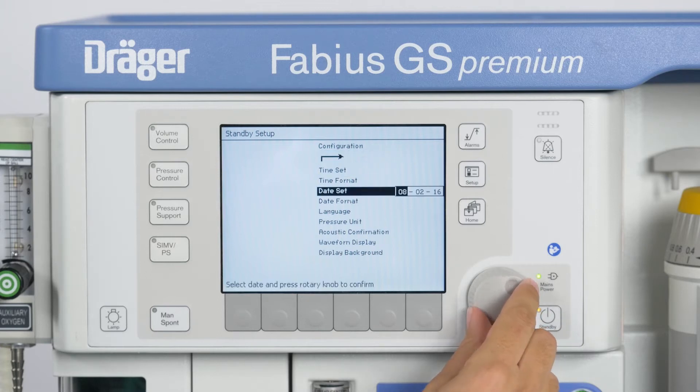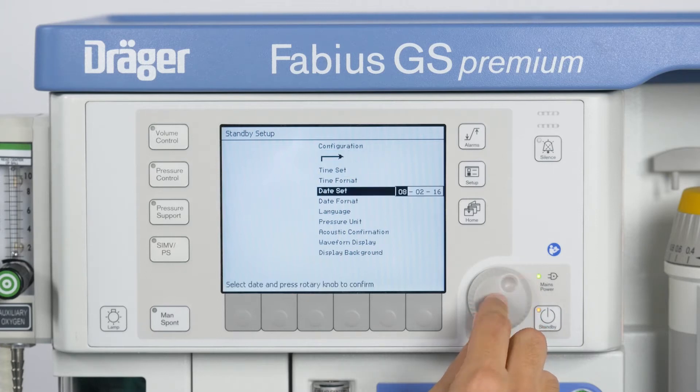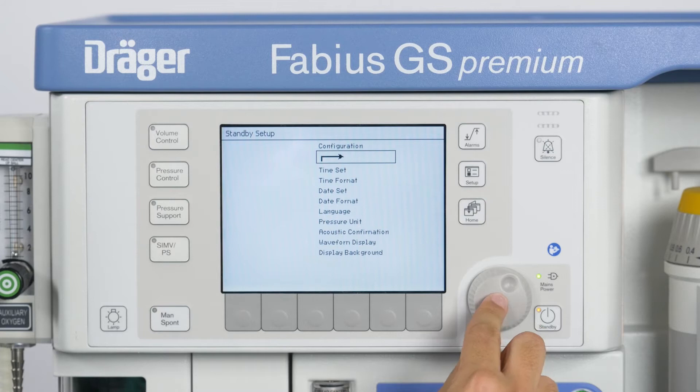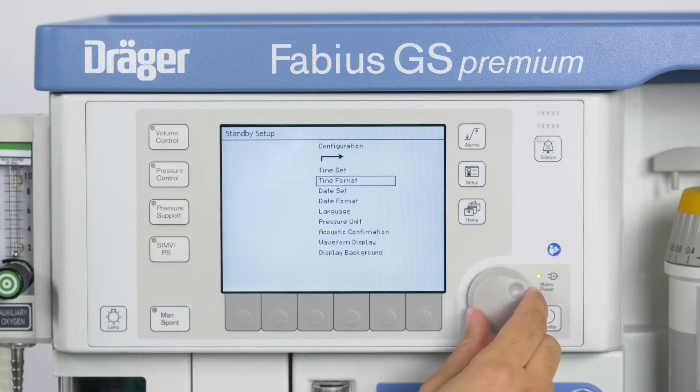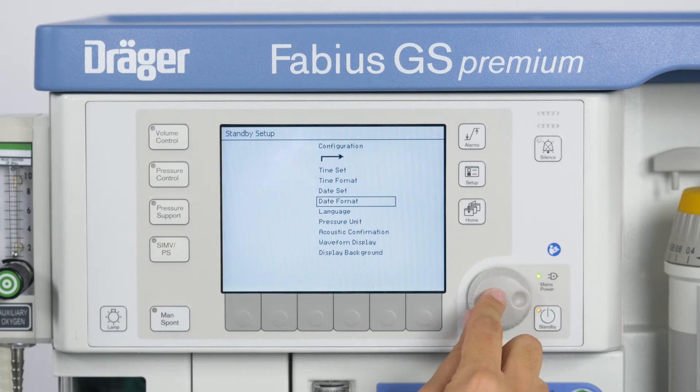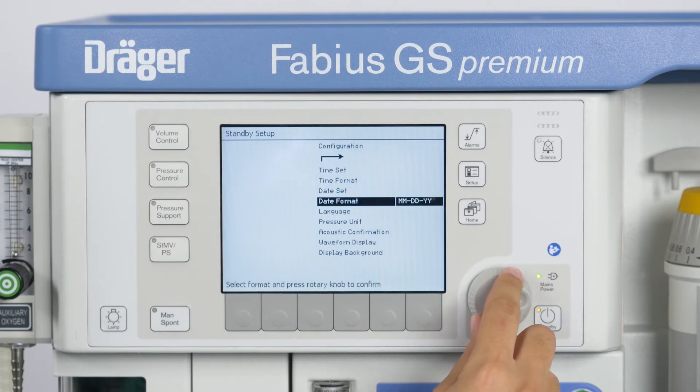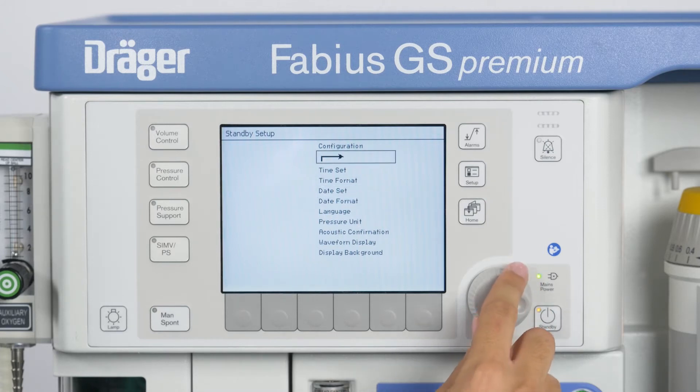You are also able to change the date via the next entry called Date Set. Date Format lets you choose between two date formats.